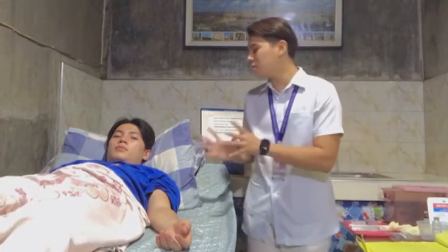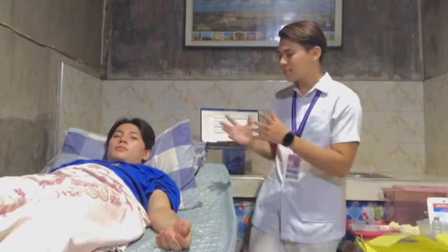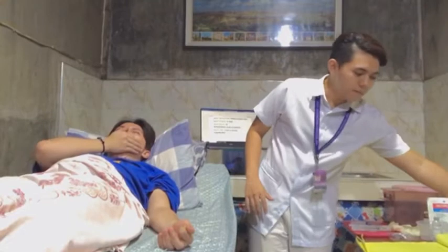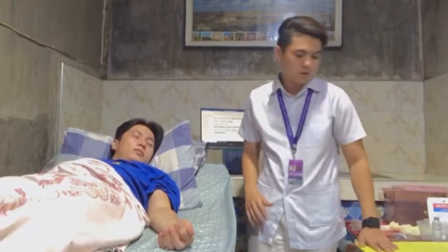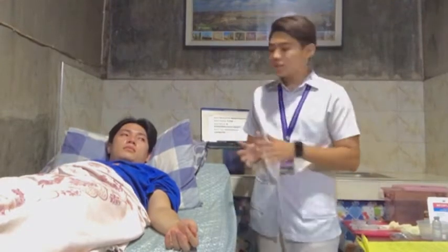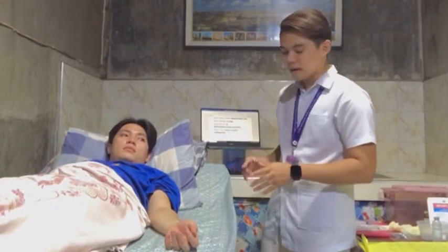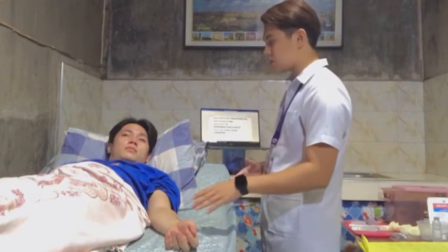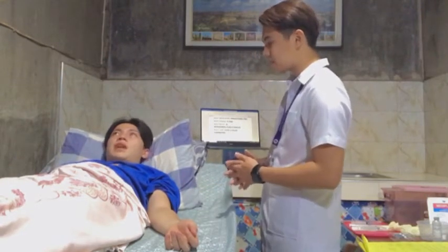And after that, also explain the procedure to the client and how he can participate during the procedure, because this will help to reduce anxiety and it will enhance cooperation. So, Sir Miles, today, in accordance with your doctor's order, I will be administering intradermal injection to you, sir. I will be using a syringe to inject the medication. Do you have any other questions?